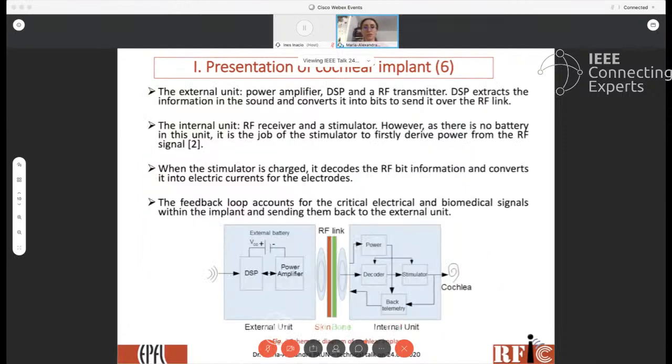So this comes in the idea of really making a cochlear implant being able to compensate for humidity in a different way by producing or proposing, first proposing and then producing, the fully equipped electronic solution to account for this compensation of both the humidity and temperature issues.